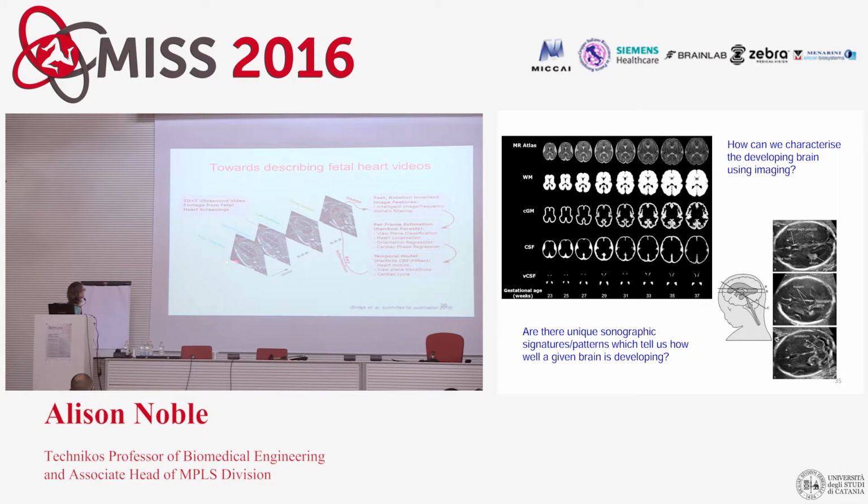How did he do that? Well, the basis of it is that you've got someone to carefully acquire those scans. So we've got ultrasound video, 2D video as they've moved the probe, and then he goes through extracting rotationally invariant image features. You need them to be rotationally invariant because the fetal heart can be in any position.